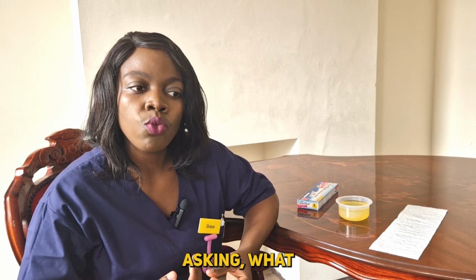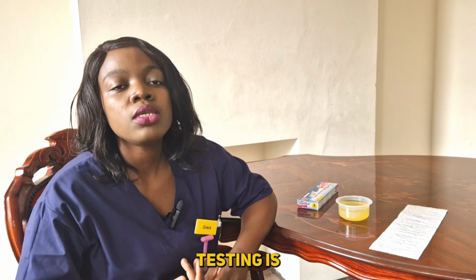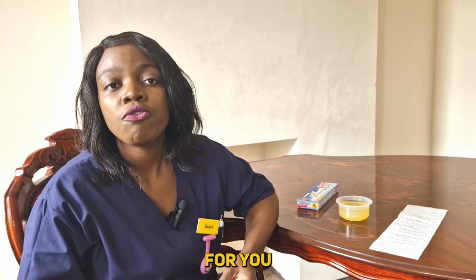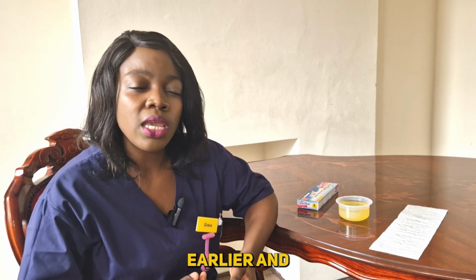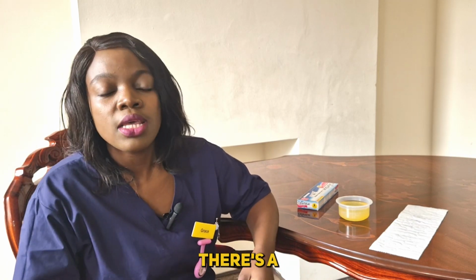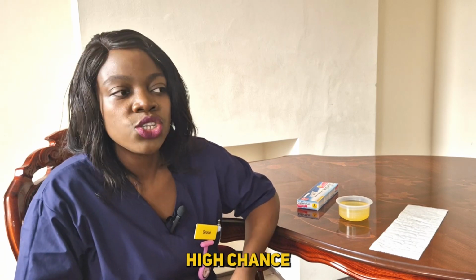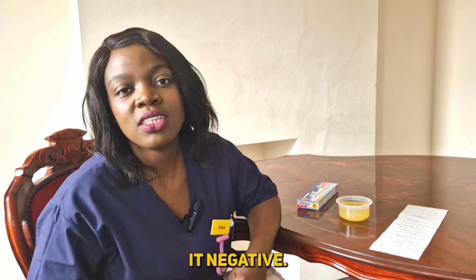People have been asking, what is the earliest I can start testing? The earliest you can start testing is 8 days post ovulation. If you're 8 days post ovulation, then you can start testing your urine to see if you're pregnant. And this happens because there are those people who ovulate a bit earlier. If you ovulated a bit earlier and immediately the sperm got the egg and it fertilized and implantation happened, then there's a high chance that you might find it positive. If it happened late, then there's a high chance that you might find it negative. Or if you're not pregnant, then you might definitely find it negative.